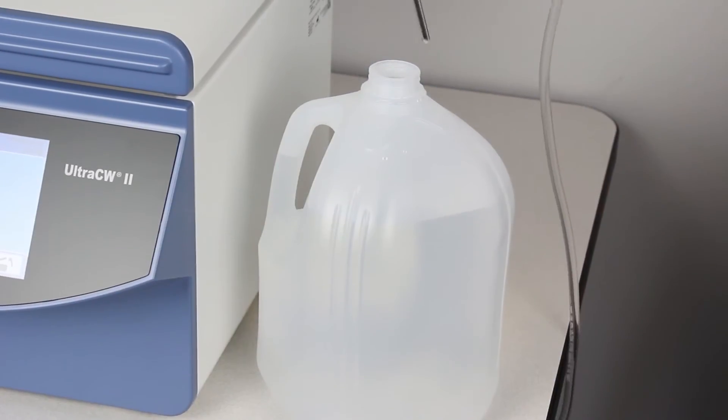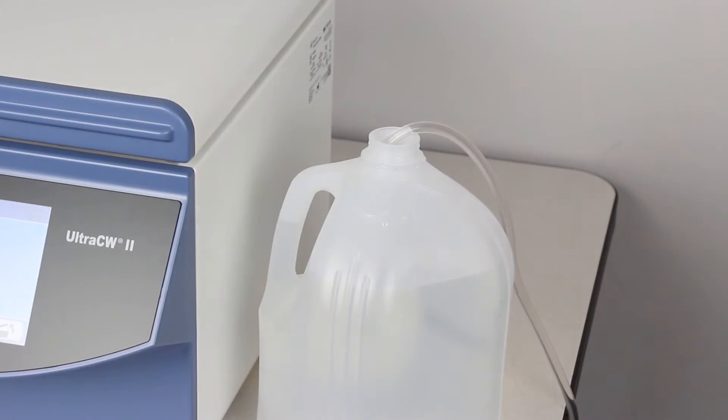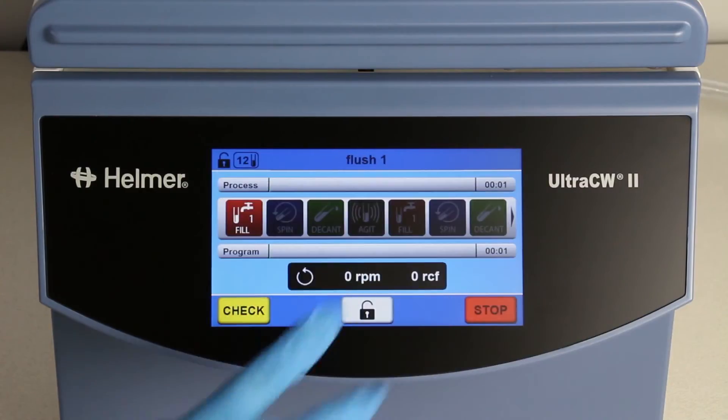Then, take the saline tube from the container and place it in the container with deionized or distilled water. Select and run the FLUSH-1 program.